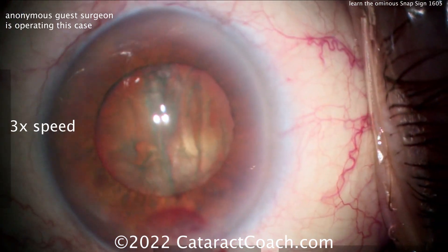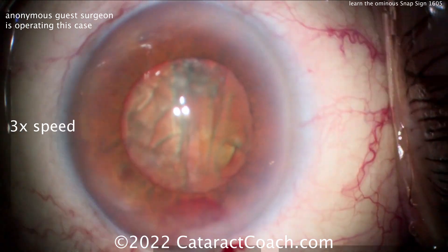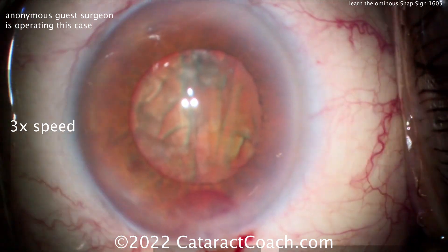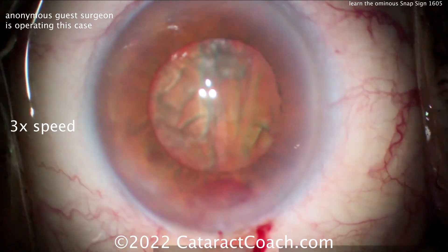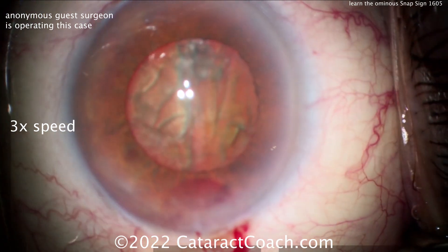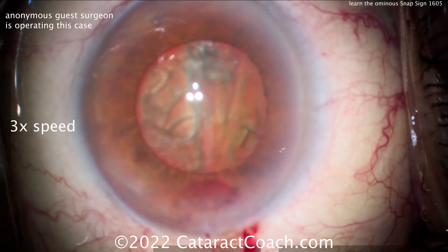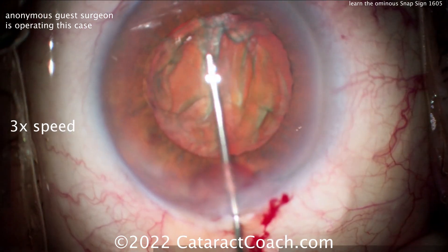So we'll finish up the case here. We're going to put viscoelastic in, and the surgeon is going to try to proceed normally, but we know what's going to happen — that whole nucleus is going to fall into the vitreous cavity. When you do the hydrodissection, try to go to the left and right sides; you don't want the cannula to block the nucleus from coming out of the capsular bag.